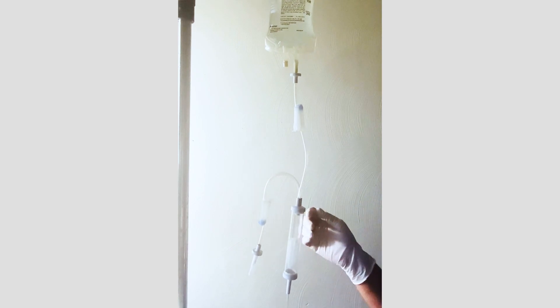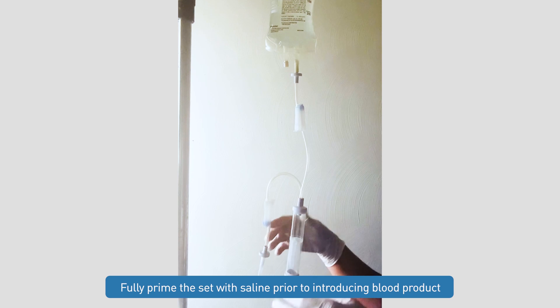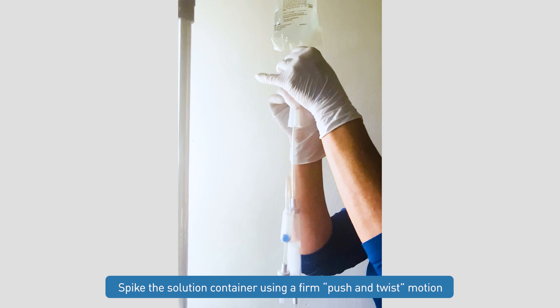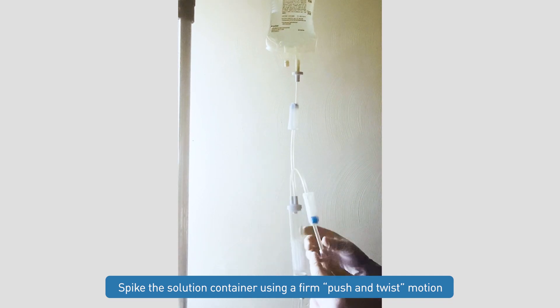Once all of our clamps are closed, we're ready to insert the spike into our solution container. We're going to completely prime this set with saline prior to introducing our blood product. When we insert our spike into our solution container, we want to use a firm push-and-twist motion, making sure that spike is completely seated in that port.